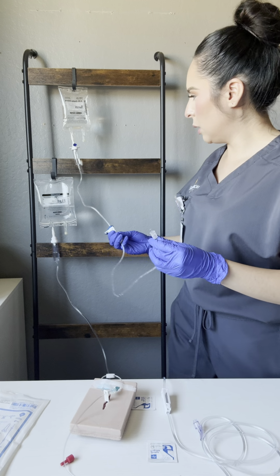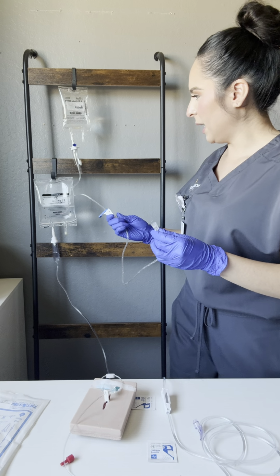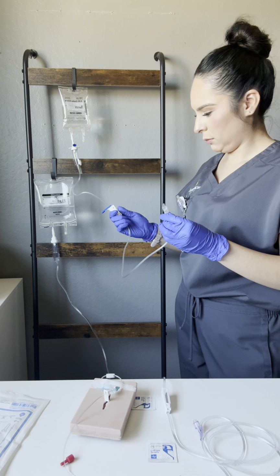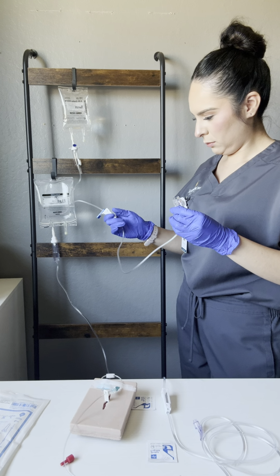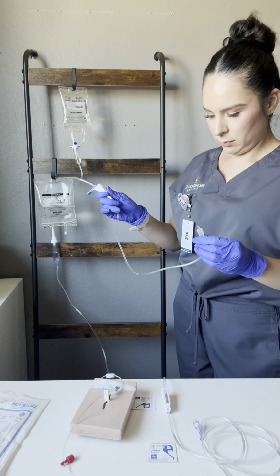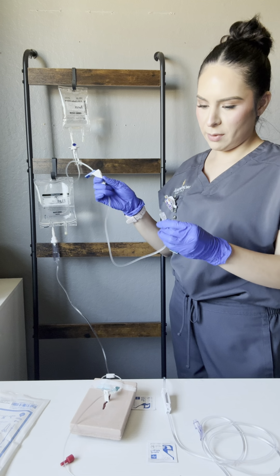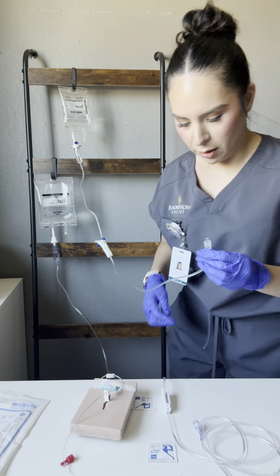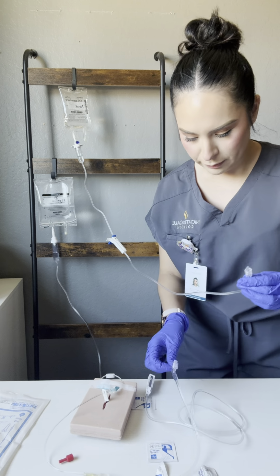And then slowly rolling up on the roller clamp to get rid of any air bubbles. Okay, now we are going to roll down on the roller clamp, and then we are going to want to locate the Y site on our tubing.